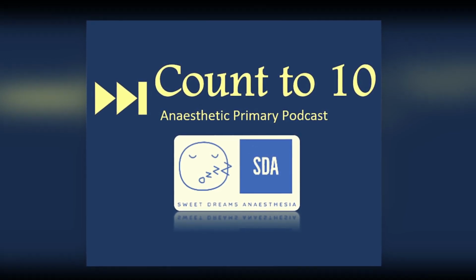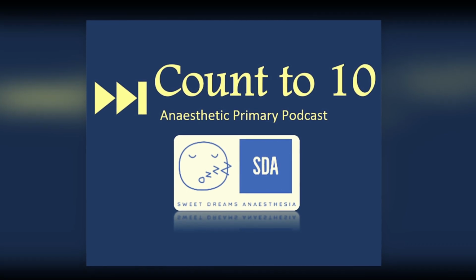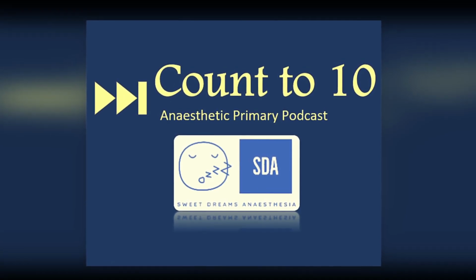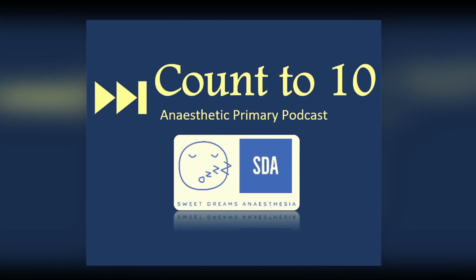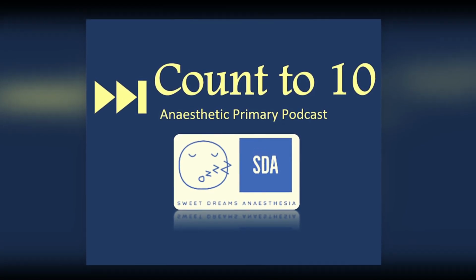Now that's the pulse oximeter in a nutshell, and it's a lot to take in the first time you go over it. But to summarize, what you have is an equipment that measures the amount of oxygen that's bound to hemoglobin in arterial blood, and it can do this because arterial blood has two special properties. The first one is that oxyhemoglobin absorbs more infrared light than deoxyhemoglobin. And then the second unique thing with arterial blood is that when it goes to the peripheries, it increases the amount of substance at that peripheral site where the oximeter is working.